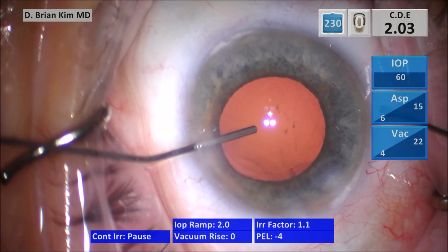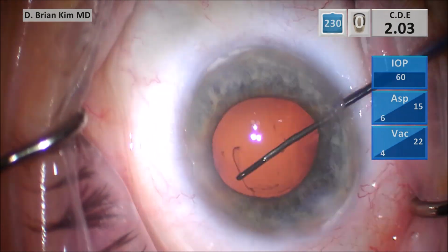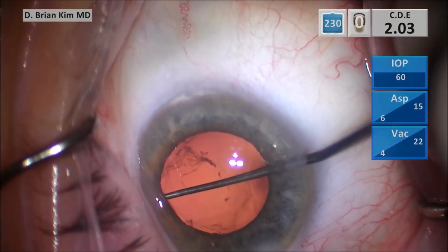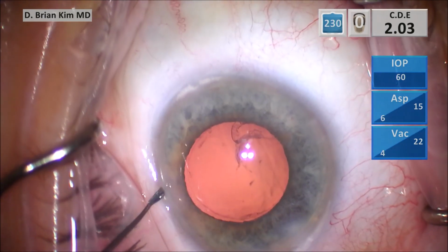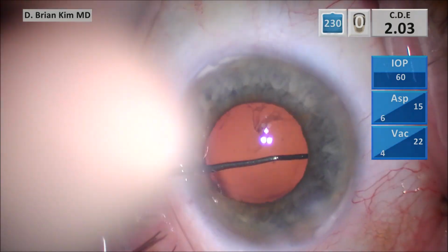If you have a loose piece, don't be going after them, grabbing them with your phaco tip near the pupillary edge. If you do that, you might grab the iris. More safe and more easily, just use a chopper to get around the lens piece and hook it and pull it up out of the bag. It's really a routine technique that I utilize, very easy.